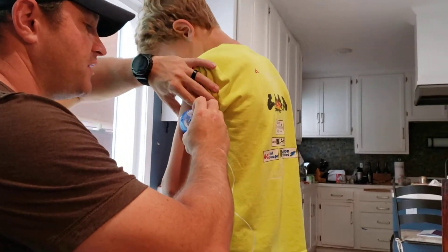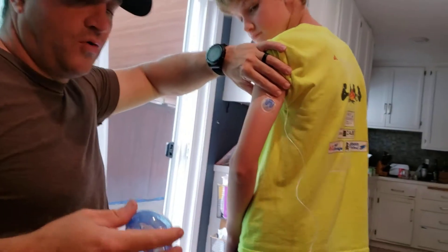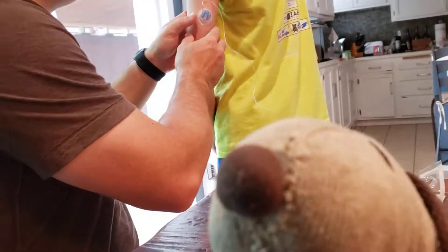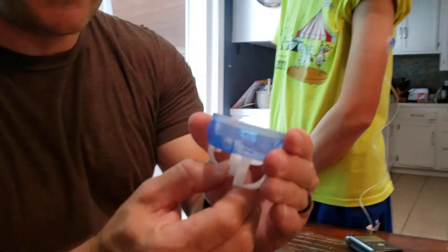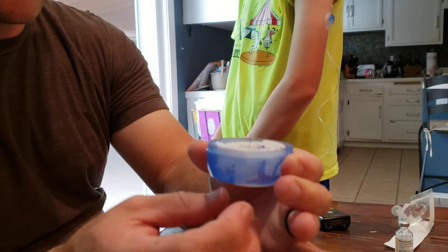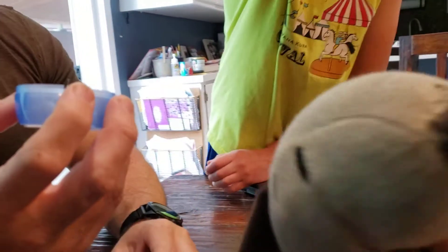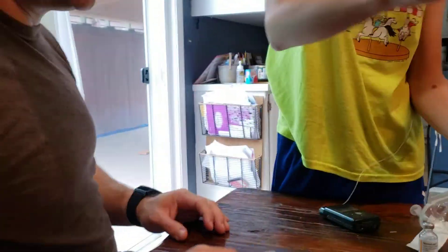One, two, three, four, five — I put my finger on the cord and then I pull this out. The funky thing with this injector is that the needle is what holds this. So when you hit both sides, it releases it into your arm. You wait about five seconds so the adhesive can stick onto Aiden's arm.